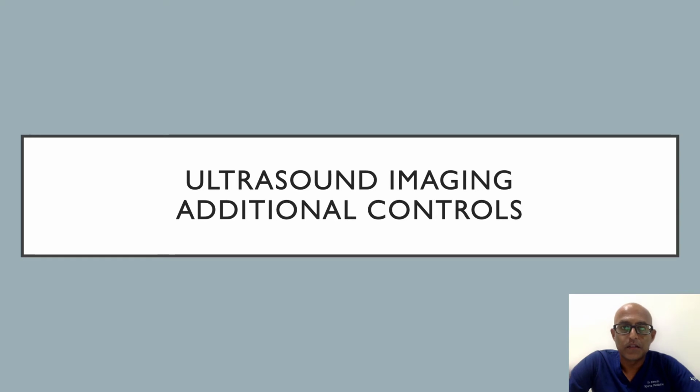I use ultrasound regularly in my clinical practice and I wanted to share with you some of the additional tools that you might find useful when you're doing your imaging. By the end of this video, you should be able to apply these in your clinical practice and hopefully they'll be helpful to you when you're assessing patients.